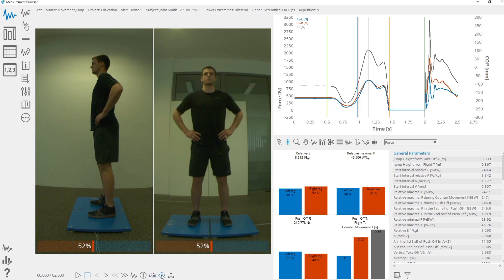The bars at the bottom of the videos represent the distribution of the vertical force between the left and right plate. This is shown only in cases when a measurement was acquired with two plates.